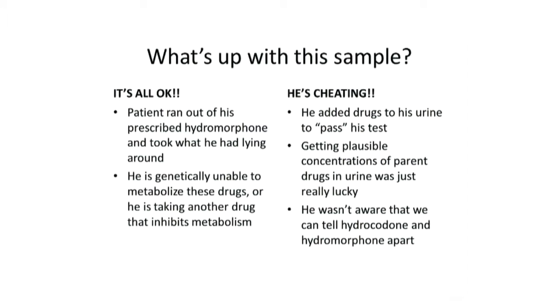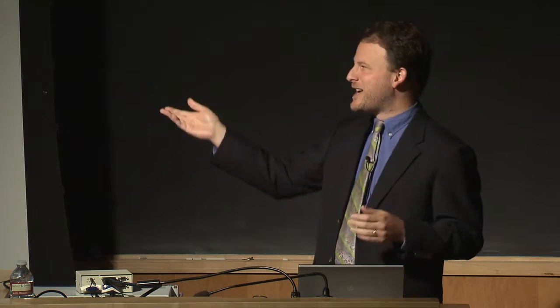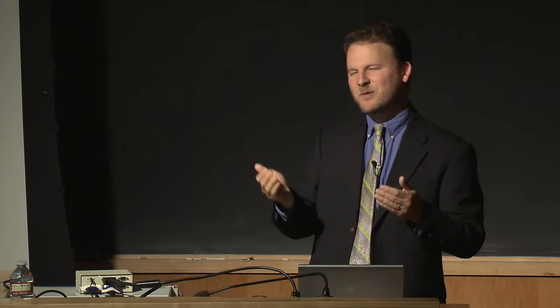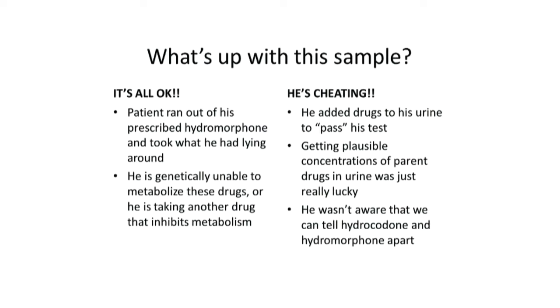So let's now talk about the negatives. Honestly, it's most likely, we see all the time that people add drugs to their urine to pass their test. What we often see is ridiculous concentrations of the drug. People don't know exactly how much to put in, so they just put a whole pill in or something. Maybe this guy just got lucky. I think he probably just got lucky, but that can balance either way, maybe it's more favorable or less favorable that he's cheating. And last, he probably doesn't know that we could tell hydrocodone and hydromorphone apart, so maybe that's why he did this.